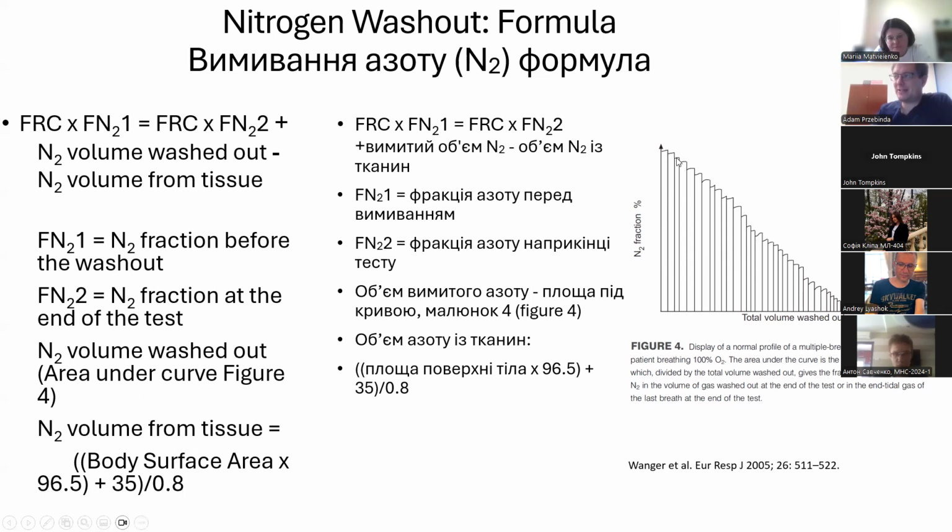And with each successive breath, the nitrogen fraction goes down, down, down, until it's nearly zero. You could either go the full 7 minutes to get all the way down here, or you can imagine if you only go 5 minutes, then you know that this is going to be a line that's going to end here, so you can kind of estimate.